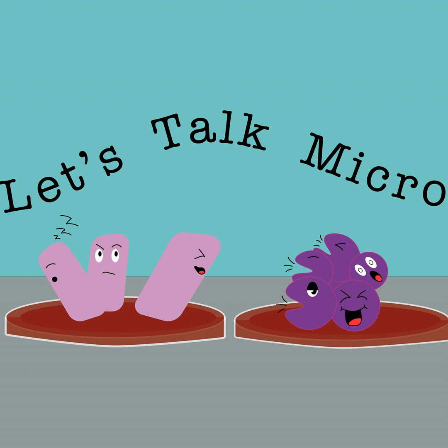So we're reporting it as an MRSA, but at that point you're not reporting the MIC, you're just reporting it as resistant. Yeah, so this is going to differ lab to lab. My personal preference is that you hide your MIC, right? Because physicians sometimes look at that MIC, and if you have an MIC of less than or equal to, say, 0.25 and you call it resistant, some of your astute physicians are going to look at that and be like, "Oh, this doesn't make sense," and you don't want them to ignore your interpretation and go by the MIC only. So we usually hide or remove those MICs from the medical record, so they just can't see them. All they get is our interpretation, and so there's no conflicting information.